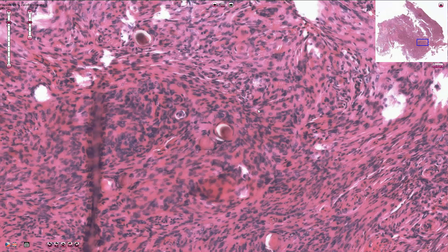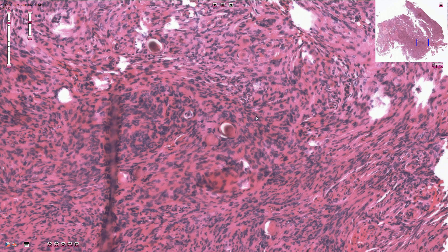We can recognize many different subtypes and histological variants of meningioma, and only some of them are clinically important because they have more aggressive behavior. For example, cordoid and clear cell subtypes are grade 2 tumors, and rhabdoid and papillary subtypes are grade 3 tumors — those are more aggressive and usually more mitotically active.